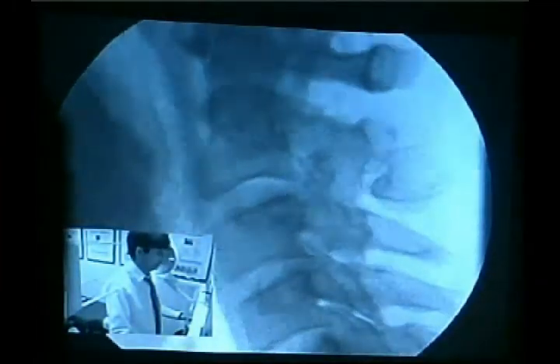Fractures we find all the time that x-rays miss. This guy owns an x-ray company. We did the motion x-ray on his neck. I go, when did you break your C2 spinous? He goes, I never broke my neck. And I said, well, what the heck's this? He goes, we've taken 100 x-rays of my neck because every new machine we buy, we do x-rays on me. I go, look how it's floating. This amazes some of the neurosurgeons how much a bone can float. Missed, because when he was non-moving, it looked like it was attached.